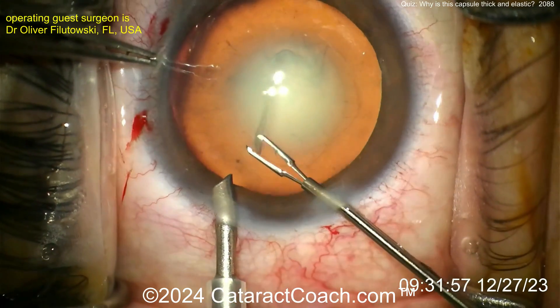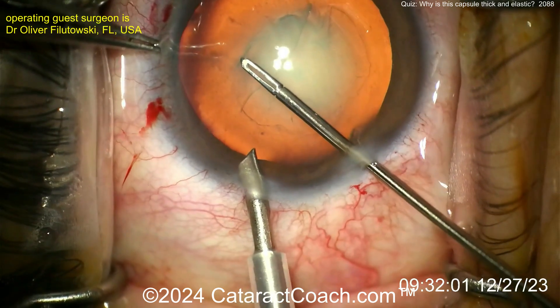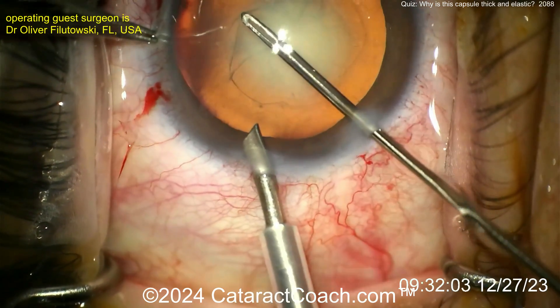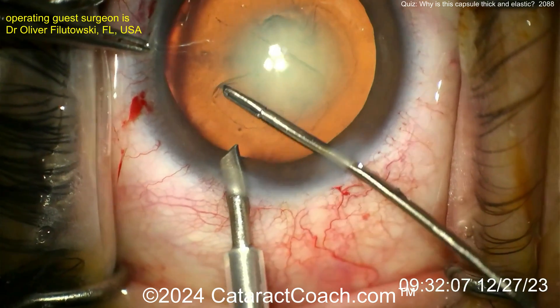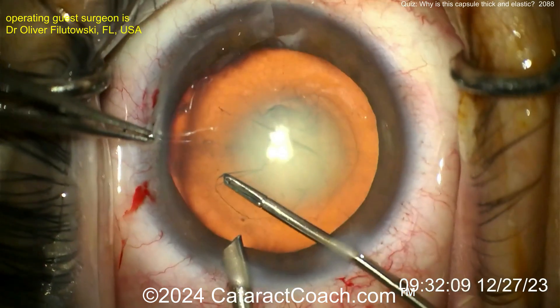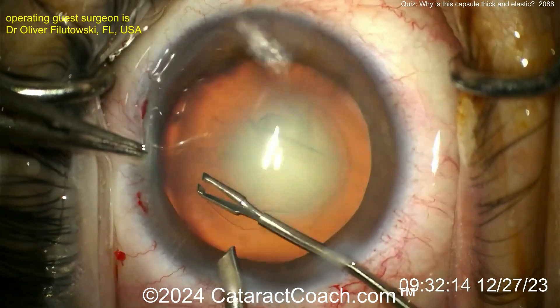It has a resistance there — it seems very elastic and very thick. It would have been nice to have the AC full of viscoelastic, as well as having the anterior lens capsule stained with trypan blue. As you know, trypan blue not only stains the capsule but also makes it less elastic. Watch as the rhexis continues — it's just a strange-behaving tissue.